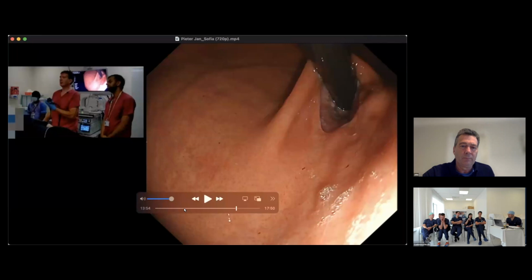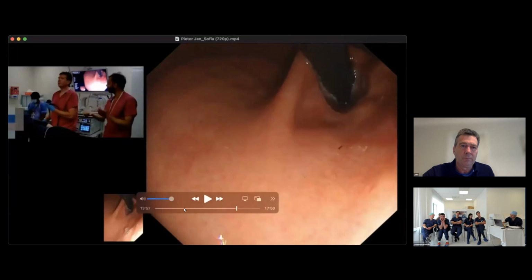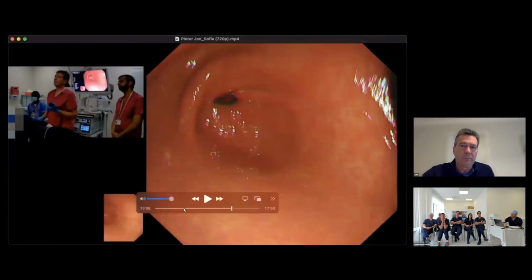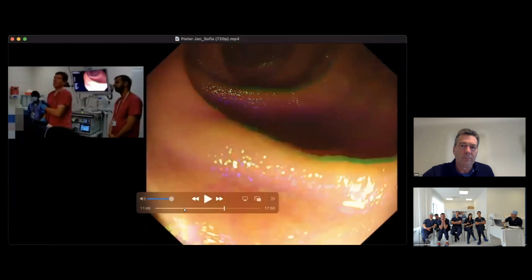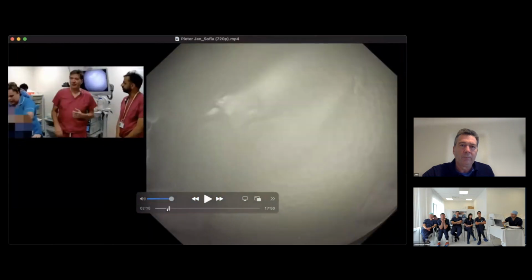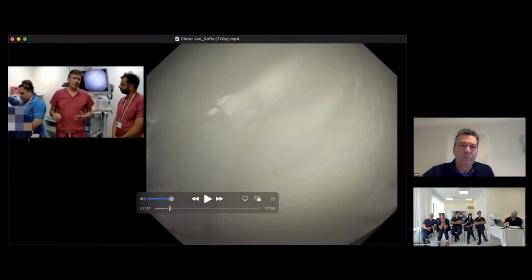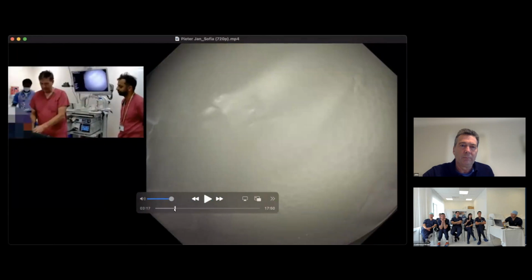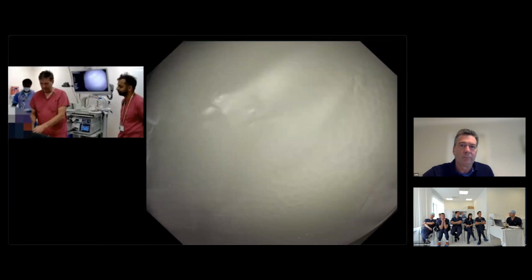Also, he checks the scope, but also whether the nursing staff is ready. Yes, it is very important because we work in a team, and above all in a colonoscopy, four eyes are better than two to look for a polyp. But also in a gastroscopy, the nursing staff is very important to take biopsies or other things. Something about empowerment there, right? Empowerment of the nurses to say something.